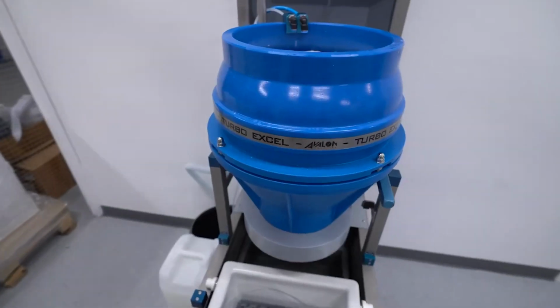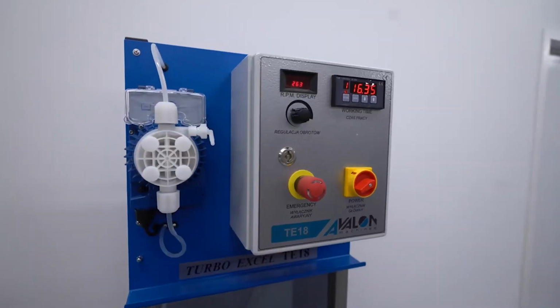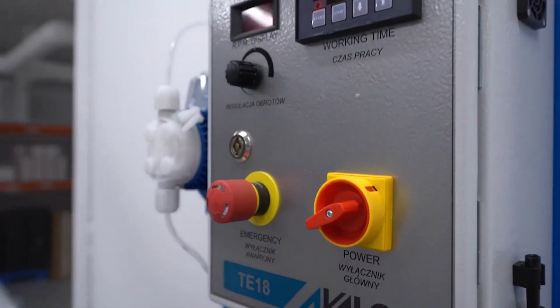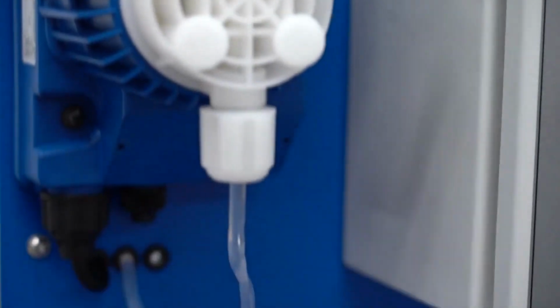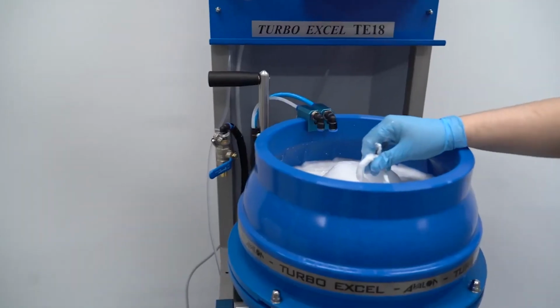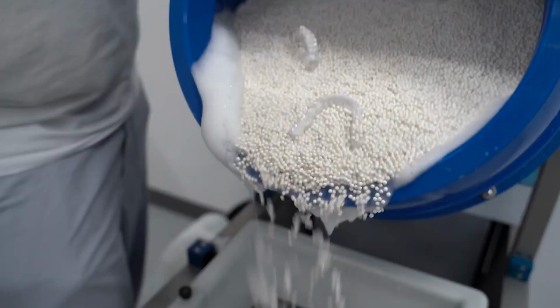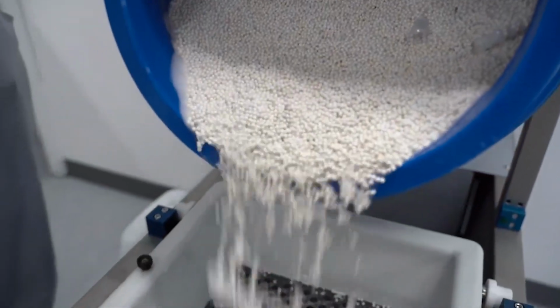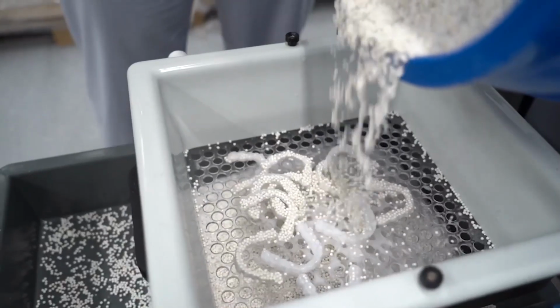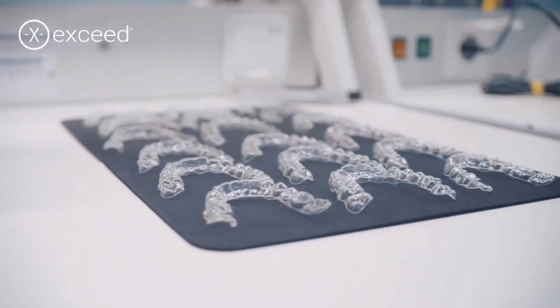So if you compare it with the manual process, also significant economy of time, 50 versus 3 aligners. So pretty significant time savings. But again, only works with the laser engraving module. So keep that in mind, because if you're not going to mark your aligners and just throw them into the tumbling machine, you're not going to be able to recognize which aligner steps you are holding in the hands right now. So having said that, let's proceed to the packaging.